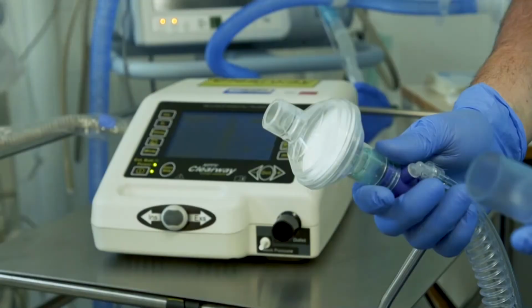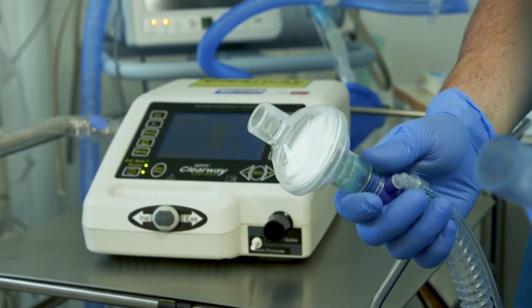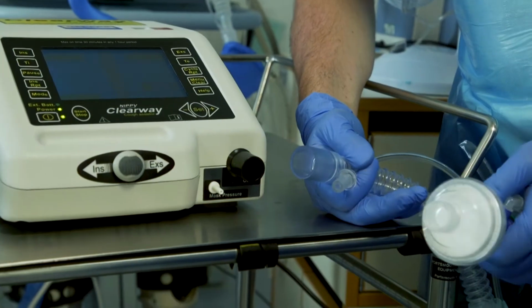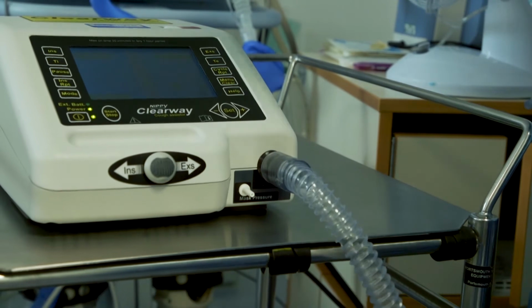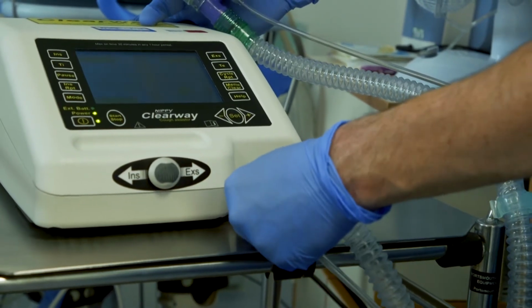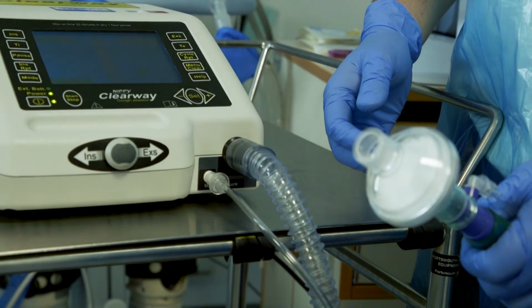The circuit is then attached to the front of the machine, with the filter being the patient end of the circuit and the wide opening being the machine end of the circuit. The wide opening is attached to the black outlet on the machine and the pressure line is attached to the white outlet.